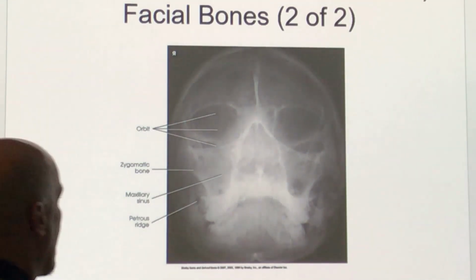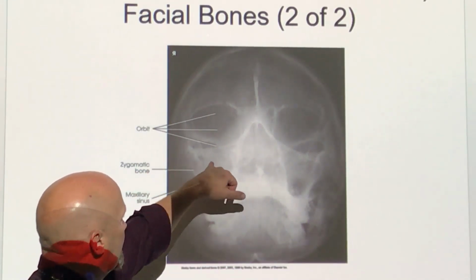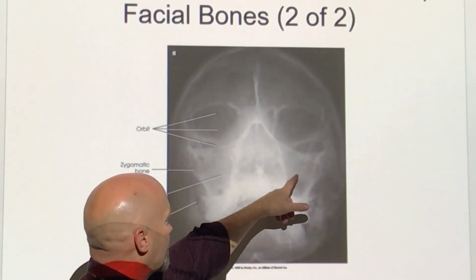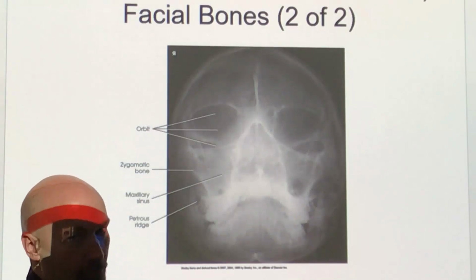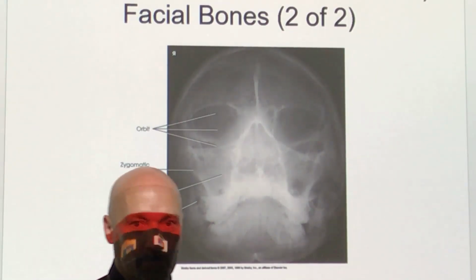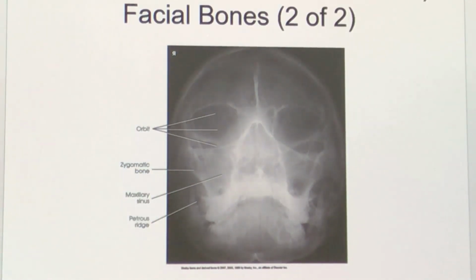This patient looks like he's probably got a blowout fracture, possibly a sinus infection. You see this maxillary sinus over here looks much more opacified than that one over there. Or more likely, since we don't see a dens here, that's an acrylic skull. And the guy just doesn't have any sinuses, probably filled up with acrylic whenever they filled him up.